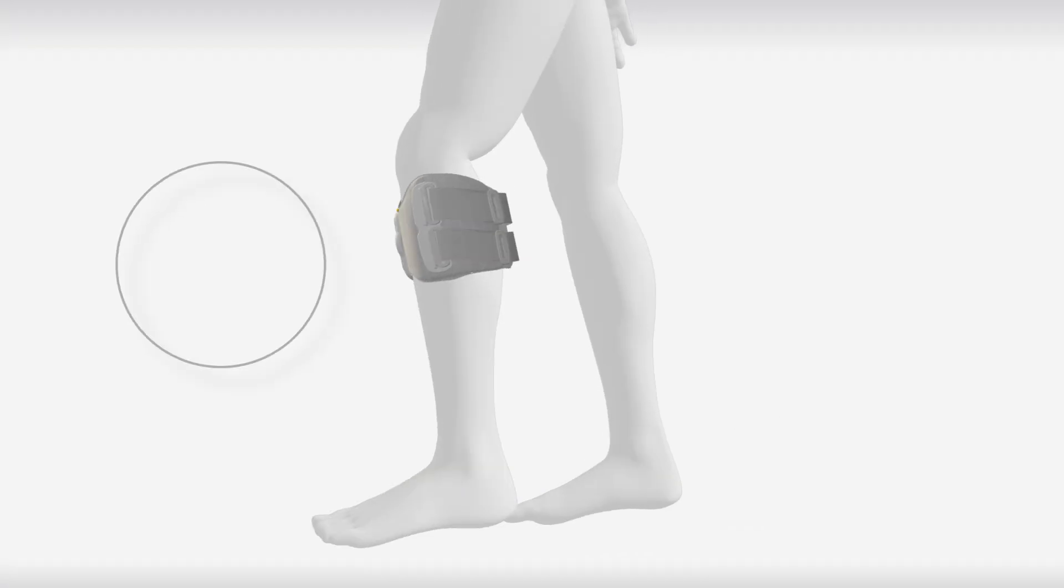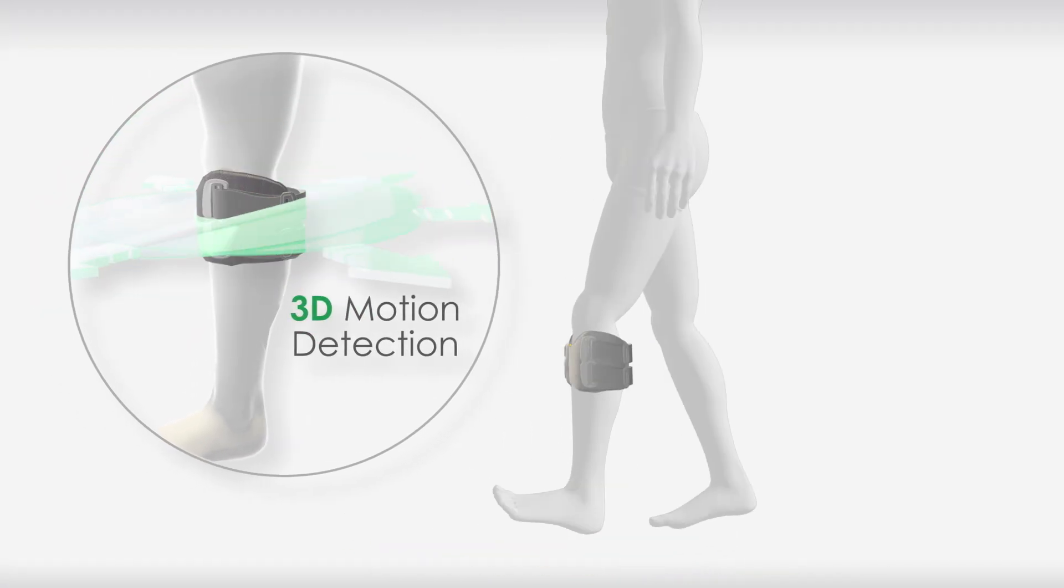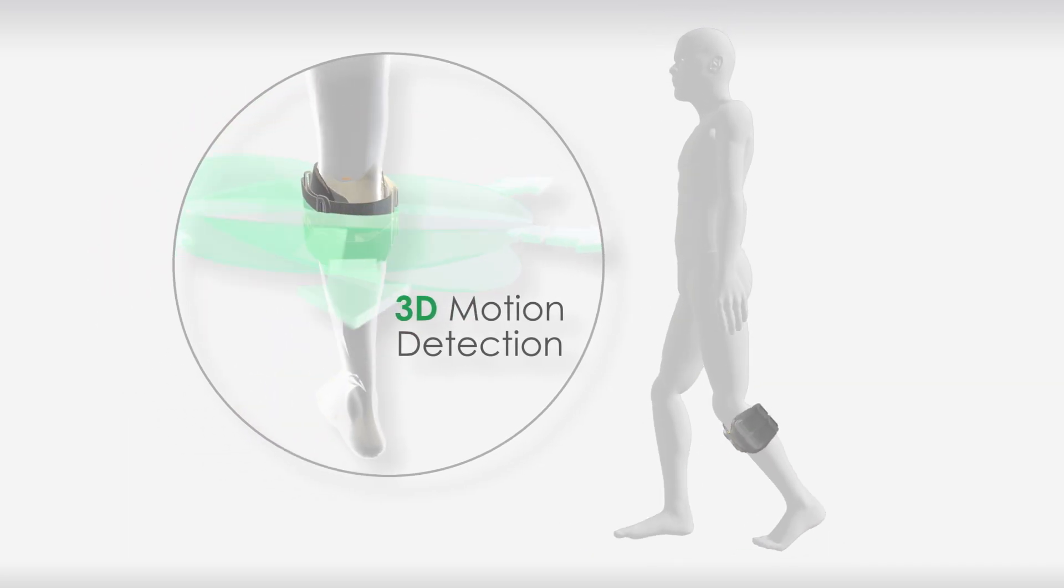Using an adaptive learning algorithm, the L300GO detects gait events, providing stimulation precisely when needed.